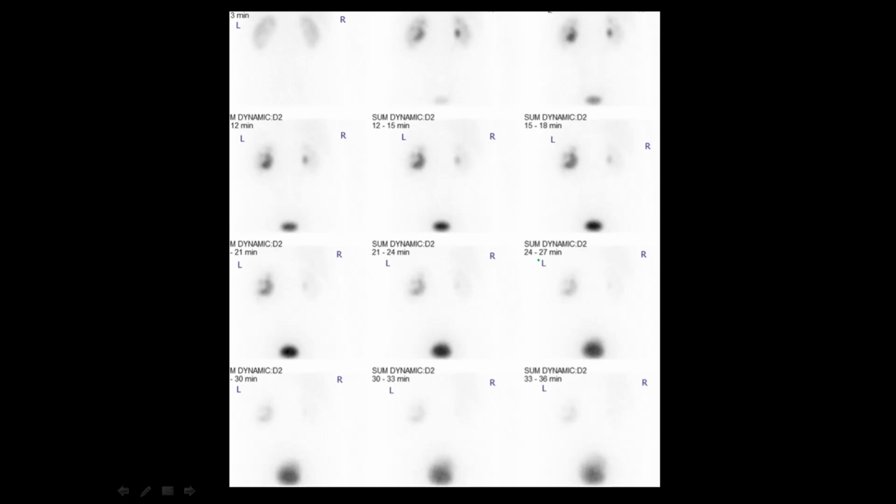And we also tend to note if the patient has symptoms at the time of the diuretic injection, because if they are obstructed, that's often the time at which symptoms may occur, because the diuretic will cause increased renal blood flow and will therefore cause increased passage of urine through the PC system and ureter. And if the patient has a PUJ obstruction, that is if they have a fibrotic band at their pelviureteric junction, which limits the amount of urine that can pass through, that will often cause the patient to develop symptoms shortly after the administration of the diuretic, and that's worth noting, so you can put it in your report.